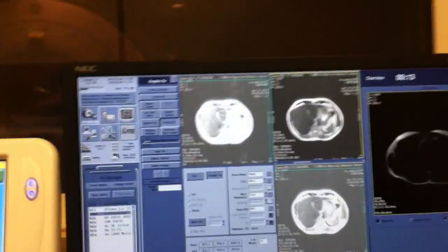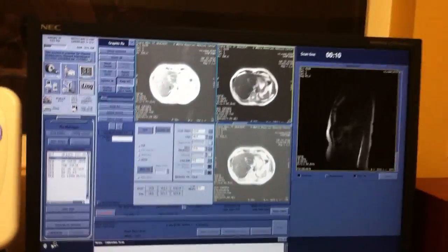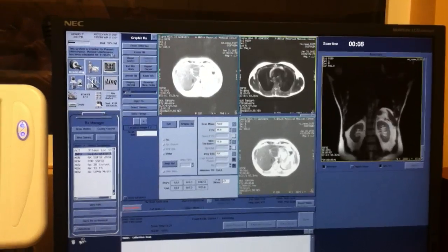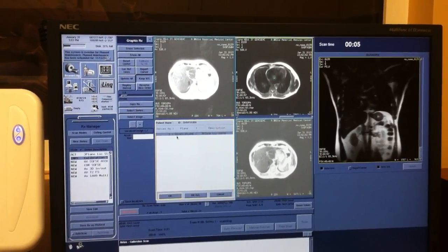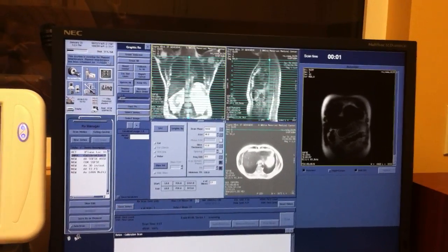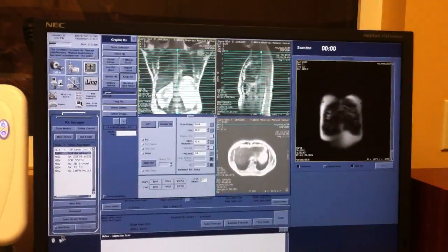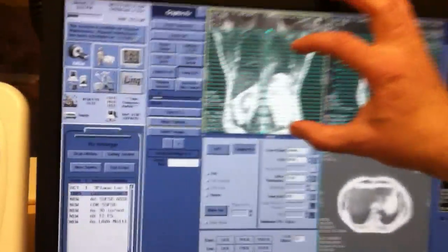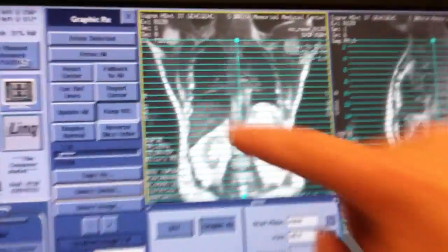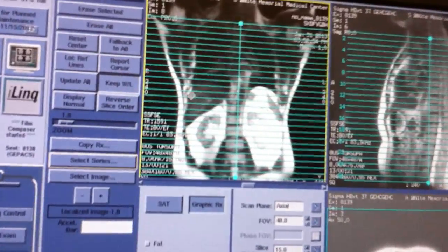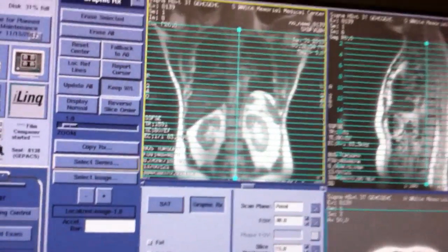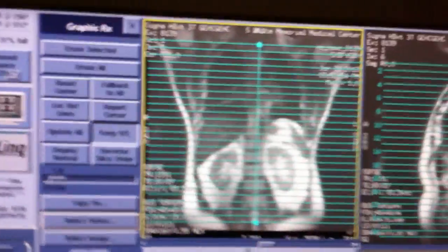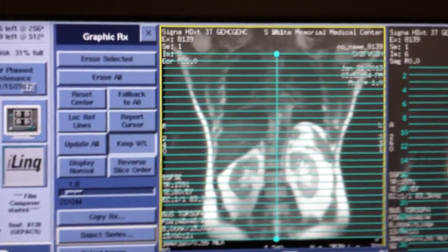Okay, so now we're setting up for our calibration. Notice the liver is now in the center of where the coil is. The coil is extending from here to here on this particular patient. So here's the liver here. I'll give you a better view of that. This is our calibration scan. It's just going to cover the entire abdomen area.